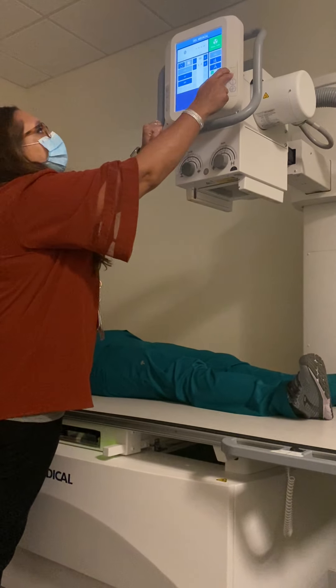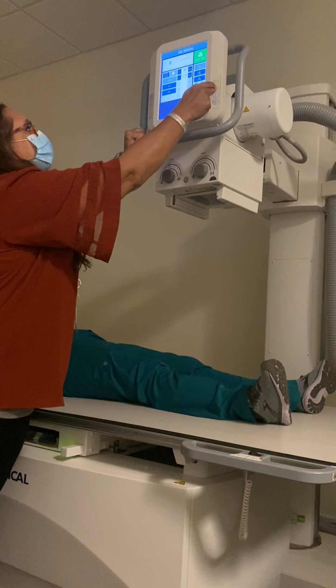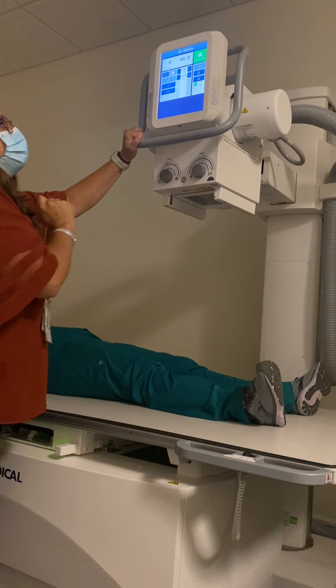We're going to pick our detector. We're going to make sure that we're in transverse detent and that we are at a 40 inch SID.